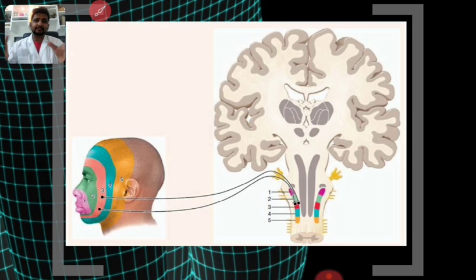So he sent me this OPG on WhatsApp, and when I saw it, I saw an upper 8 which was grossly decayed, carious, and I told him immediately, whatever you're doing with your lower arch, don't do anything, just ask your oral surgeon to remove this upper 8. He told me that the pain is in the lower. I just told him, this tooth you're not going to use, just get this removed first. I am quite sure that this is the reason for your pain.